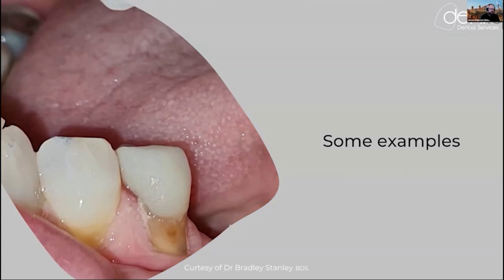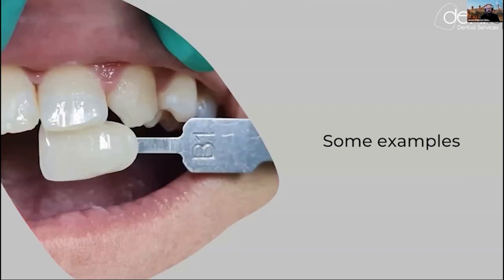This is a premolar we put in. The picture is not the best, but we have really great aesthetic results. This one is one of the few I'm really, really proud of. This case is done with only basically surface texture and polishing. So no staining, nothing else has been done, and we've got a really, really aesthetic result.